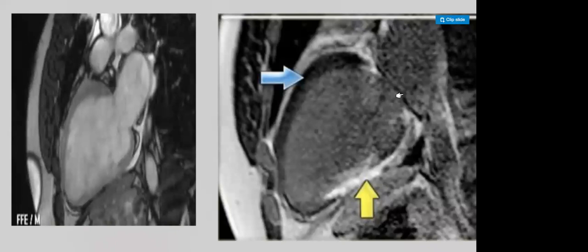And one of the other important tests which we can use, especially using the cardiac MRI, is called perfusion imaging. Perfusion imaging is especially important, for example, for peri-infarct ischemia, and this is normally performed after pharmacological stress using either adenosine or dipyridamole, or even again at rest, approximately 15 minutes after the stress imaging to allow blood pool washout of gadolinium chelate.